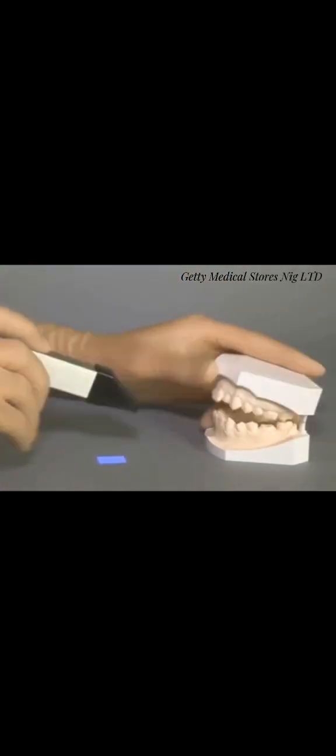We open a new patient and select a new restoration. In this case, it is a full crown on tooth 3/6 in biogeneric individual mode to be milled on the MCXL unit. We choose the Sirconia Blocks PC material, confirm with OK, and click the double arrows in the step menu. We are now in acquisition mode for the lower jaw.